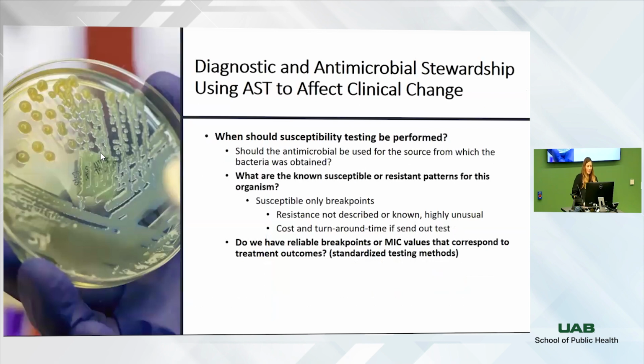Okay, so this kind of takes me into my research a little bit. Now that y'all have a lot of background for non-antimicrobial susceptibility researchers. So most of what I do outside of looking at large swaths of organism resistance, getting all the E. coli that we looked at the past year at UAB and looking at resistance patterns for that, for example, I do a lot with diagnostic and antimicrobial stewardship.